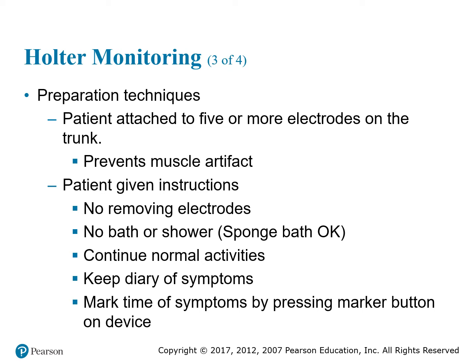For male patients with considerable chest hair, we might have to shave or clip that area so we can stick the adhesive patches onto them. For a female, we would usually stick the chest leads beneath, but never on top of the breast, because they're going to be moving around. No matter how secure their bra is, their breasts are still going to move. So we usually put it underneath their breastplate.